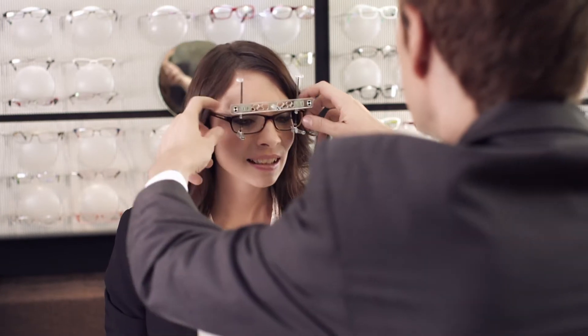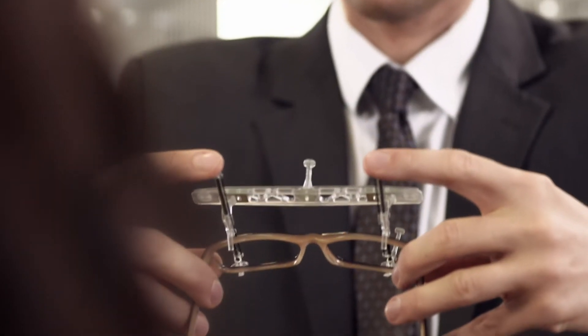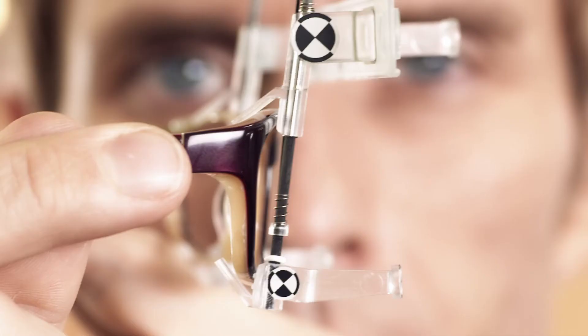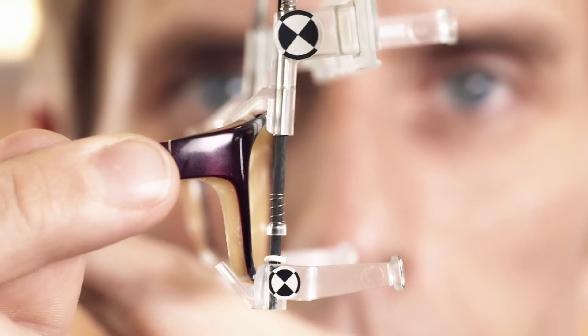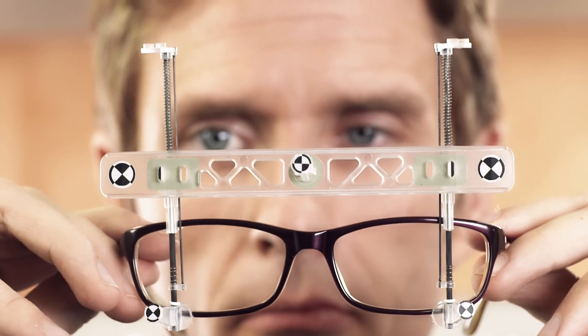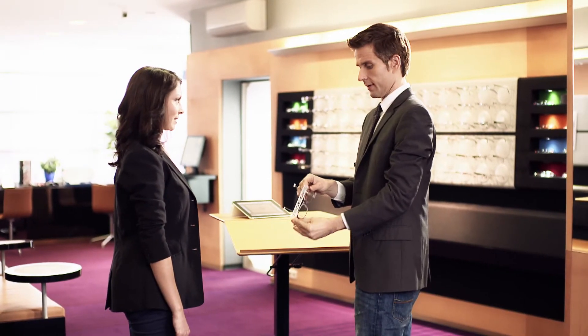Take off the frame with the measurement tool attached and check if the tool is placed exactly in the middle of the frame. Check if both spring struts are aligned parallel to the face form plane. Check if the bottom retaining bars stick out vertically from the rim of the frame.